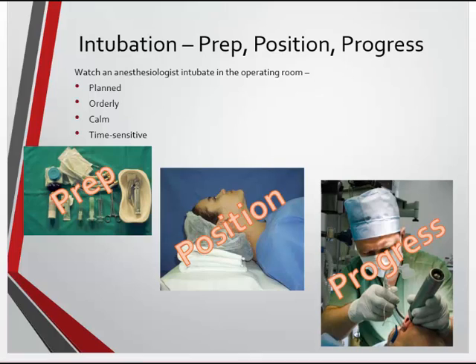Three things to remember when we're doing intubation. And this is review, but it's important review. A lot of us forget some of these things as we get older and spend more time in the field. So I call it the 3 Ps. We're going to do prep, position, and progress.